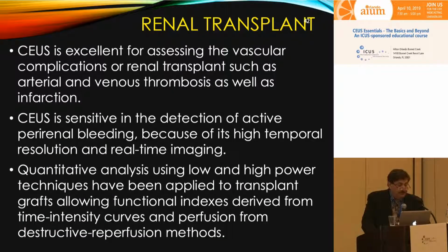Excellent for renal transplants, for looking for vascular complications, such as arterial or venous thrombosis, as well as infarction. CEUS is sensitive in the detection of active perirenal bleeding because of its high temporal resolution and real-time imaging. Quantitative analysis using low and high power techniques has been applied to transplant grafts, allowing functional indices derived from time intensity curves and perfusion from destruction-reperfusion methods.